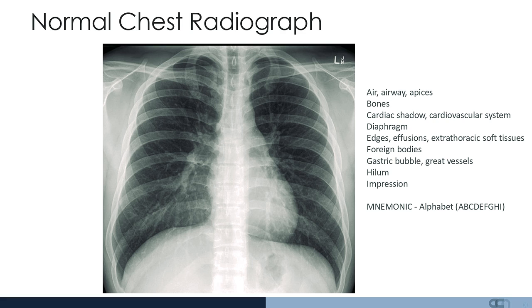The gastric bubble does not appear to be enlarged. There's no evidence of any diaphragmatic injury. There's an expected superior right hemidiaphragm compared to the left, and you notice that the hilum also appears normal. There's no evidence of effusions, consolidations, collapse, or pneumothorax all the way through to the apices of the lungs. And peripherally, there's no evidence of surgical emphysema.